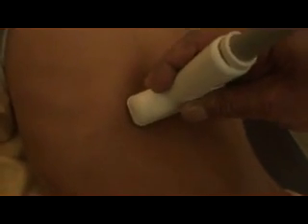Now keeping the probe in the epigastric region and maneuvering it a little bit, I wish to get the splenic vein. This is the splenic vein. This is the aorta. This is the superior mesenteric vein, and this is the splenic vein, and a band of tissue anteriorly is the pancreas.